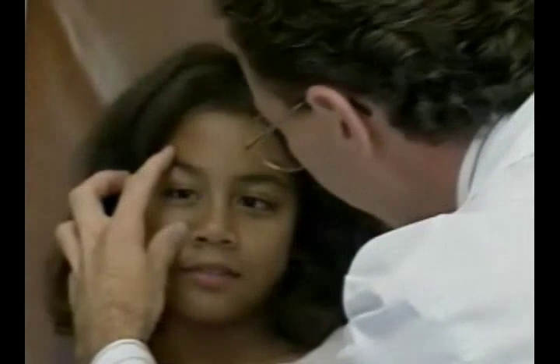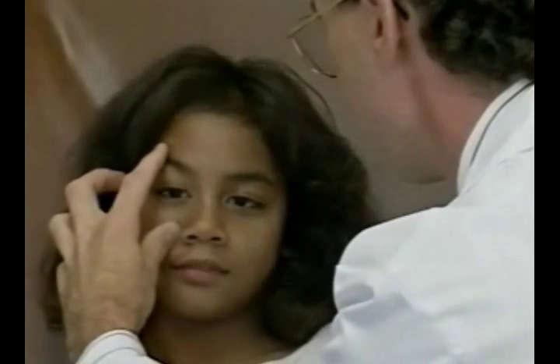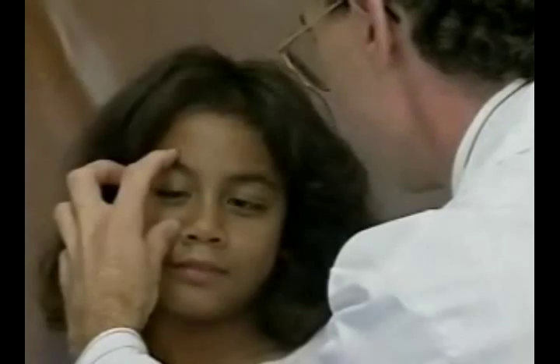How long will my eye last? Your ophthalmologist or ocularist will be the best person to advise you about when you need a new artificial eye. Generally speaking, you can expect your artificial eye to last 5 to 7 years. However, it may be longer or shorter depending on each individual situation. This schedule does not apply to children who may require more refittings due to natural growth changes.